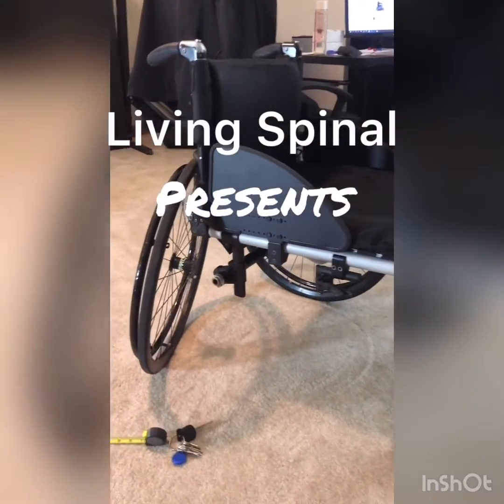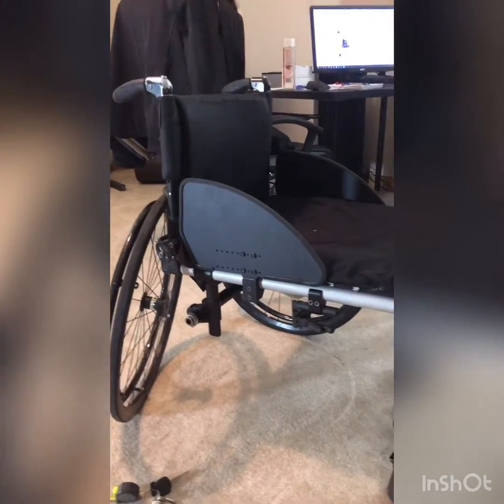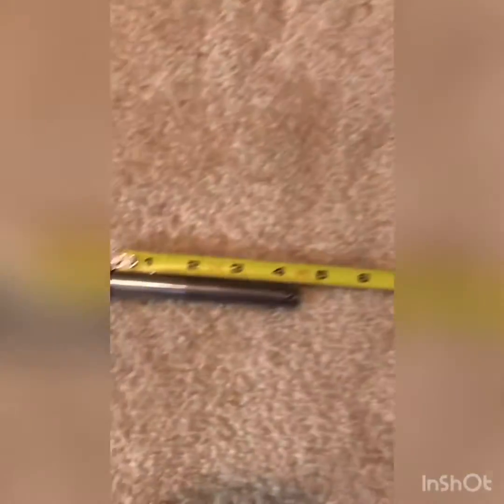Quick video on how to find the length of your axle pin for your existing wheels or new wheels. This here is a Tie Lite wheelchair. I have the wheel already taken off, as you can see, and we'll start by looking at the existing length of the axle pin that came out of the chair.